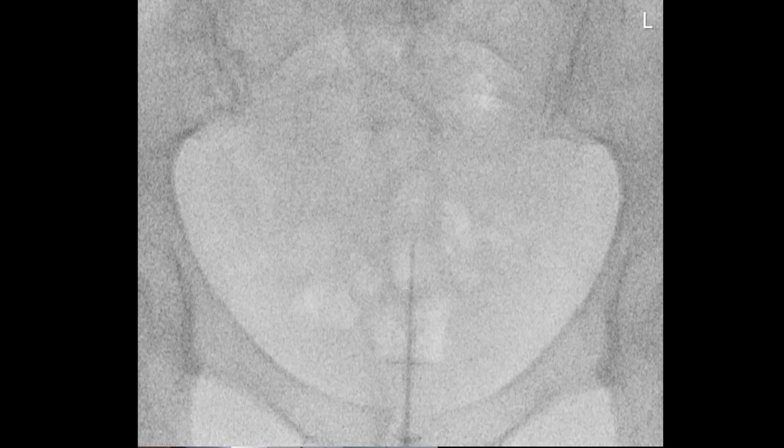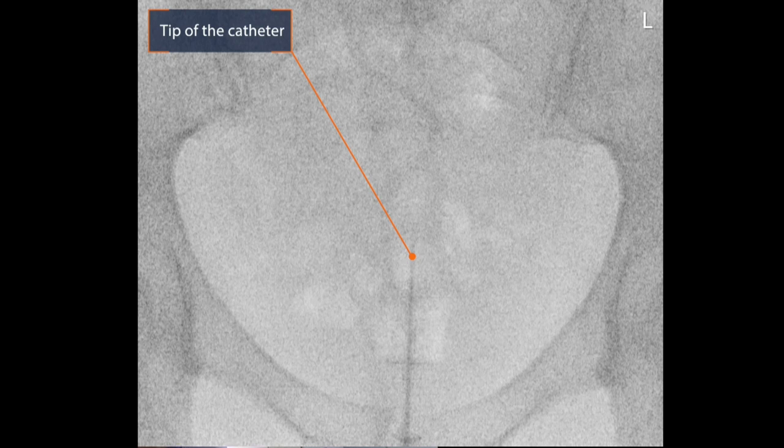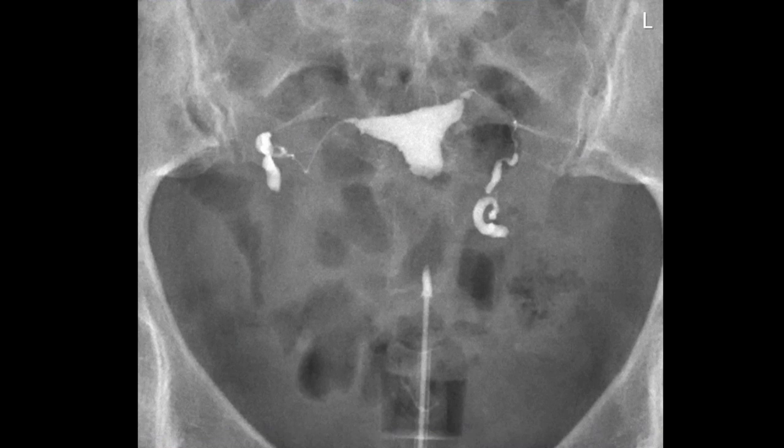Over here you can see the bone structures, and over here you can see the catheter — the tip of the catheter — and the vacuum cup filled with contrast medium. This is the next picture.